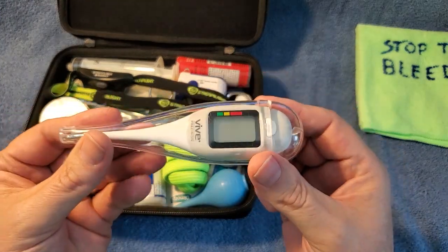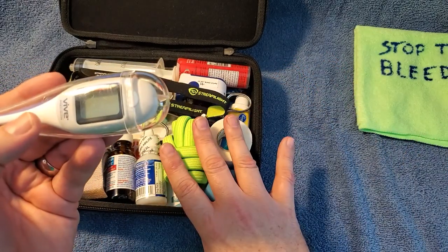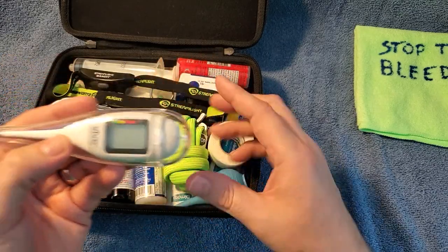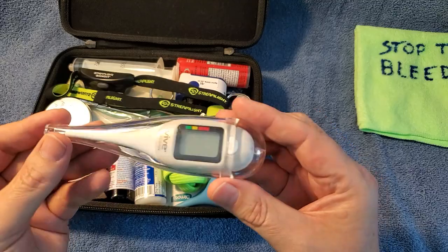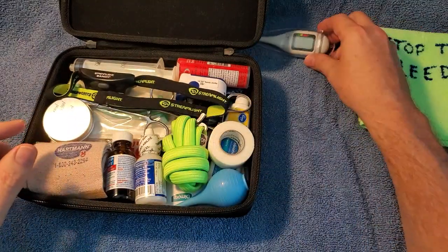Thermometer. Now, this is basic first aid. This kit has everything from first aid for boo-boos, to medium first aid, heavy first aid, and trauma. I like the electric thermometers. Make sure you always have extra batteries though, because this one gives you a really fast temperature reading right off the bat.